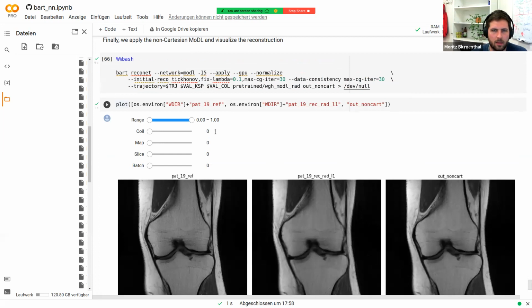And then, I'm not sure if that is sufficient for the use case we are talking about. But if you have a different amount of spokes for different slices, you could think about also providing a pattern. You will need to have the maximum number of spokes as a dimension of the trajectory and also of the k-space, but if you have fewer spokes in one slice, you can set the k-space corresponding to those spokes to 0 by providing a pattern, and therefore it's quite flexible.